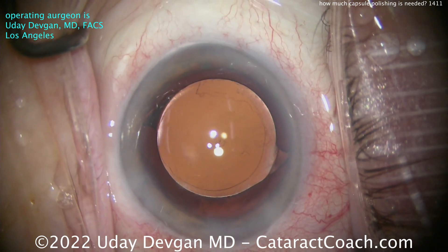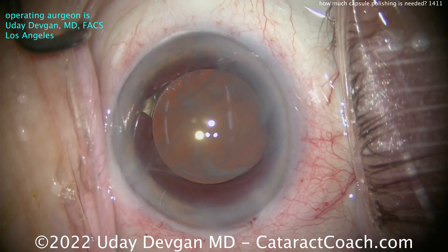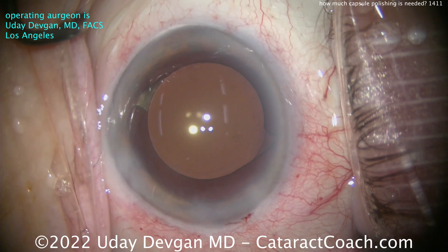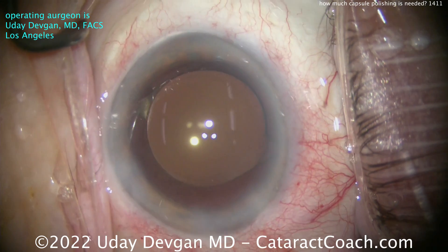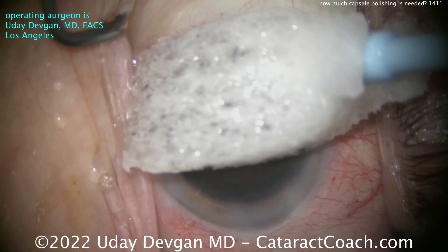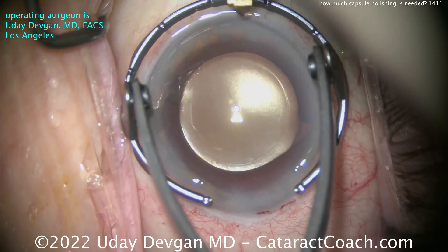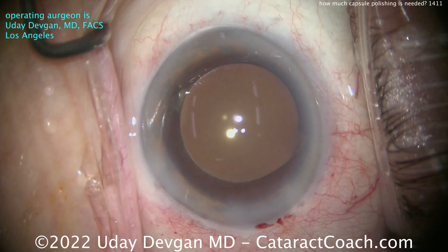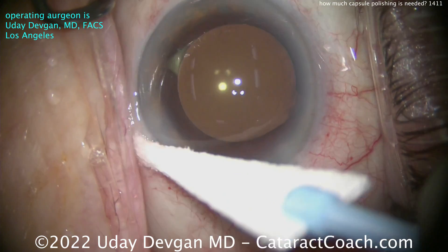Incisions are sealed nicely — this patient will do great. Let's give her some preservative-free Triamcinolone, swirl that around, a little more BSS, and finish with some preservative-free Moxifloxacin. The patient has a little bit of against-the-rule astigmatism, steep at 180, so that phaco incision is going to help. Pairing that with an LRI — a limbal relaxing incision made with a diamond blade — will neutralize that out and the patient has a beautiful outcome. Like everything else in life, there's a balance: don't polish the capsule too much.